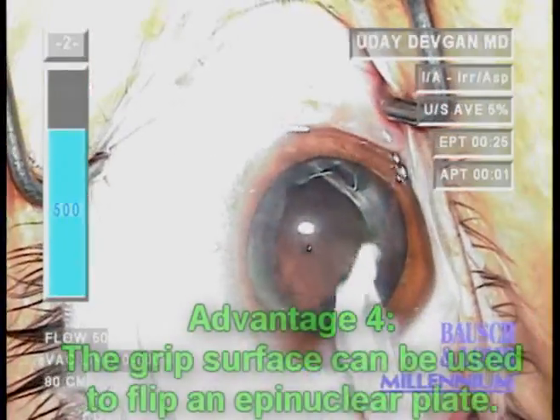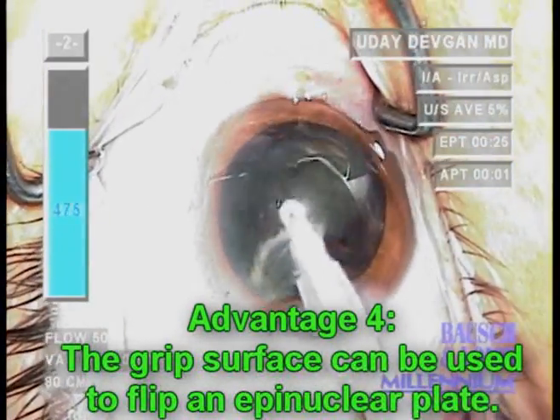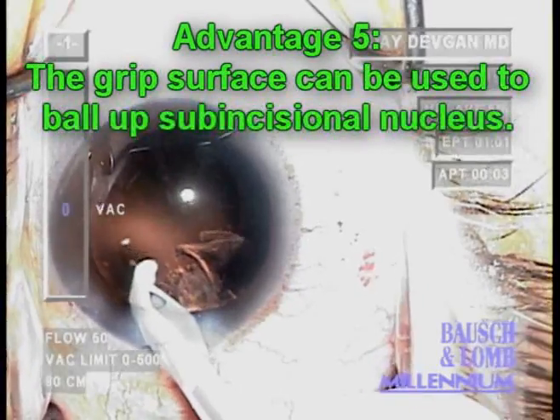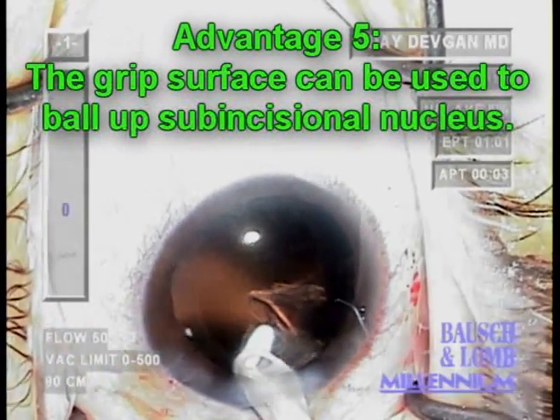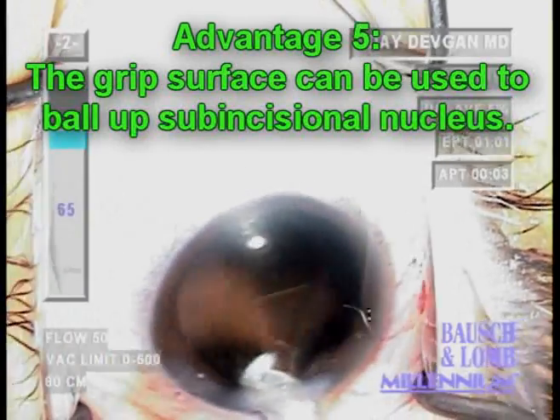The grippy surface can also be used to flip an epinuclear plate, as we see here, or to ball up the subincisional nucleus with friction and remove it as a single piece.